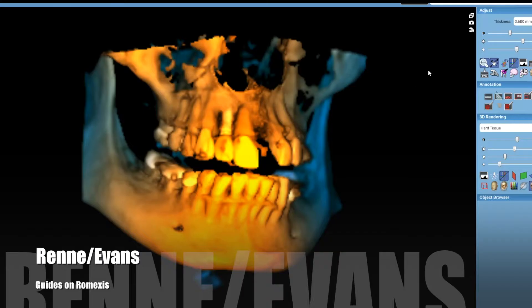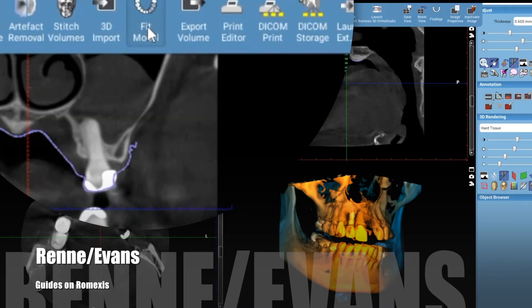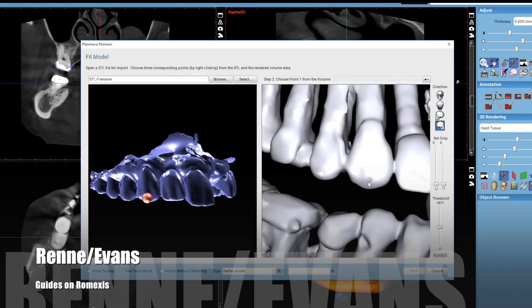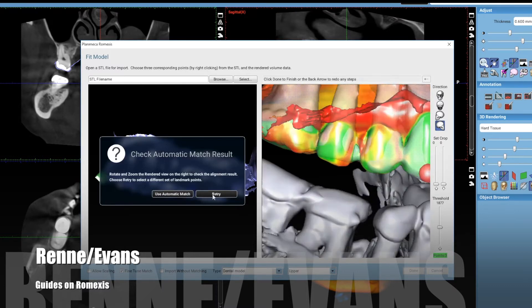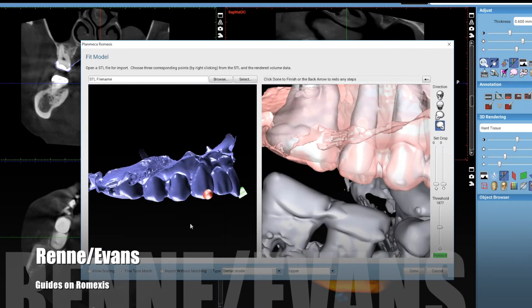After you design the tooth, you're going to load the DICOM data for the patient. Here we're going to merge the scan we just took with the DICOM data. You go up to the fit model icon and select from your Emerald scan — though you could use any STL here from any system. You start by clicking three common data points spread out a good bit, and then it's going to do a best-fit rendering.